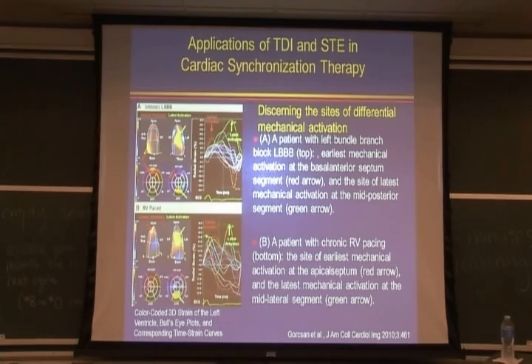But you can see the earliest activation is there, and the latest activation is there. So there is a marked mechanical dyssynchrony of different segments of the heart, which you can map out in 3 dimensions.